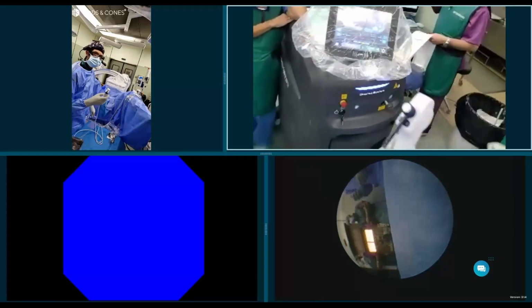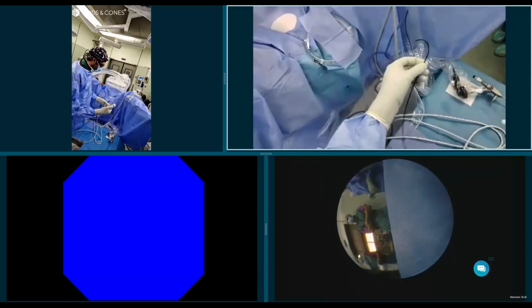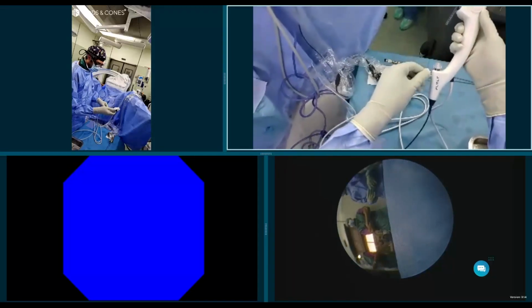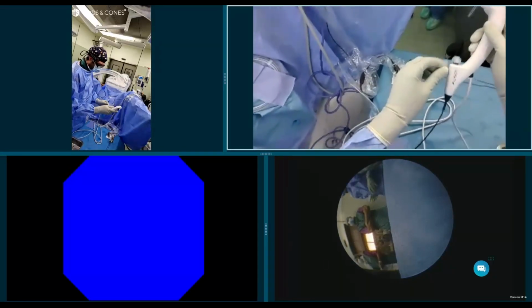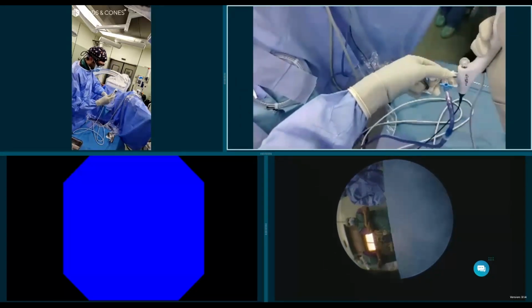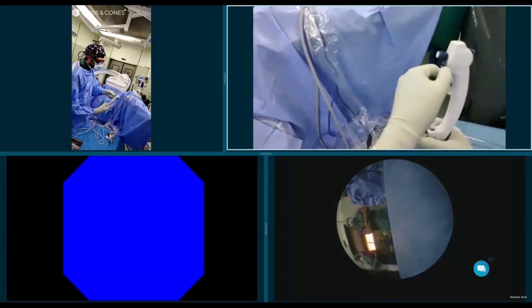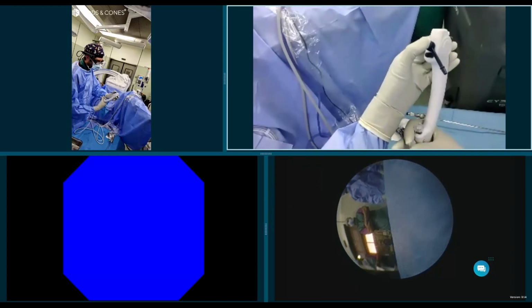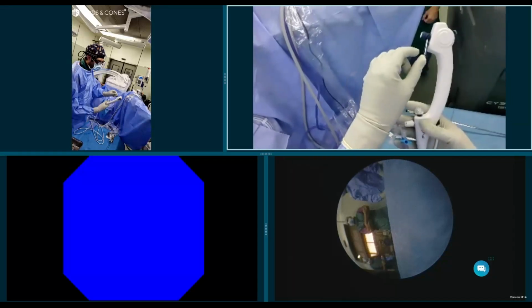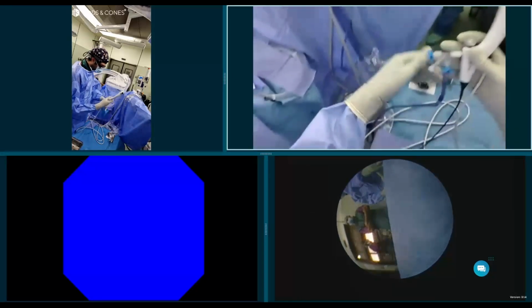So as you can see here, podemos conectar aspiración, por favor. So this is the Pusen, 7.5 French. It has bilateral deflection. So this Pusen has an inner channel to put the irrigation here. Working channel is already here, so we need to remove this. And this special button is for aspiration. This is the in-suction device. We're going to connect some aspiration here that is going to be used if needed.